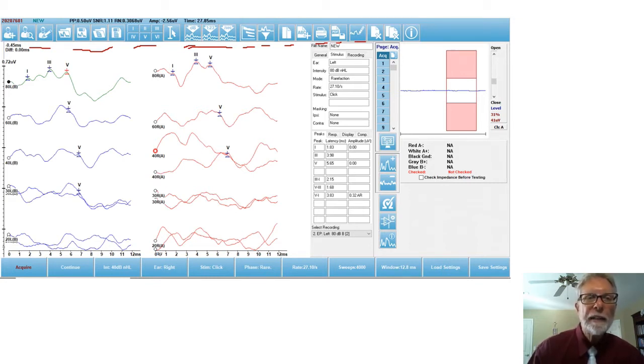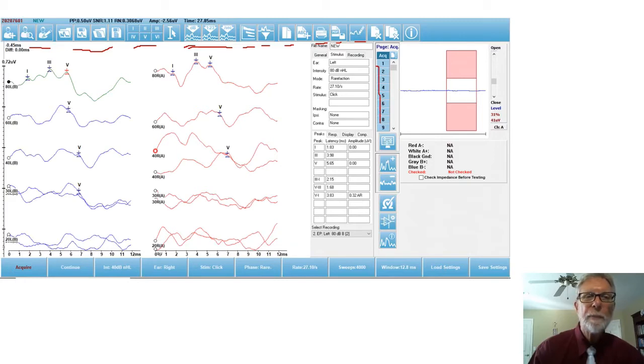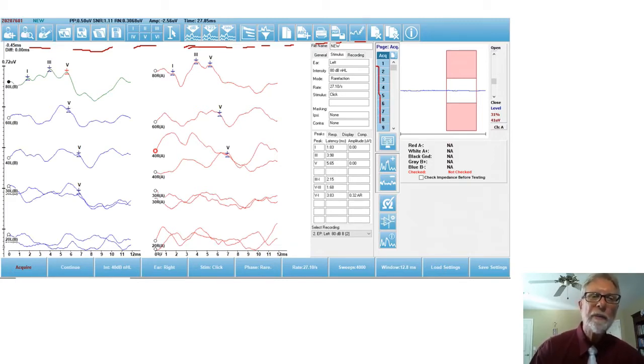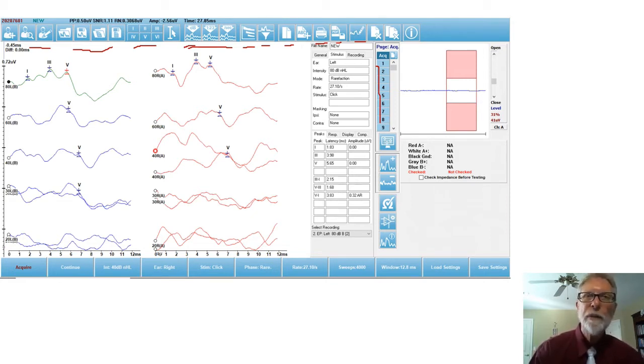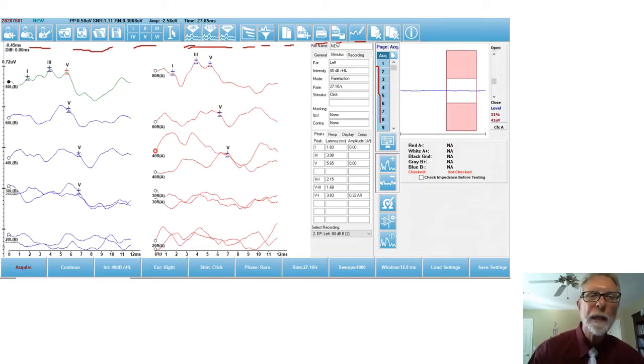Next to that, this I found is really, really convenient. This list right here, that's pages. You have nine pages and you can assign whatever you want to each page. For example, if I did ABR, ECOG, VEMP, OAE on a patient, I want my ABRs to be page one.